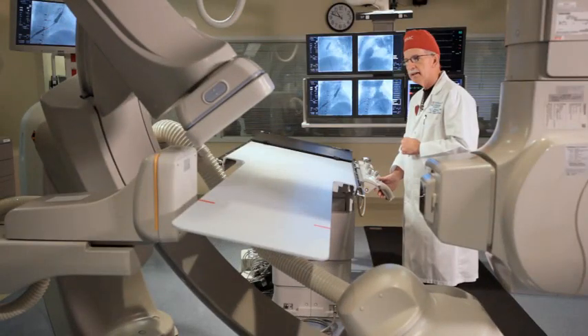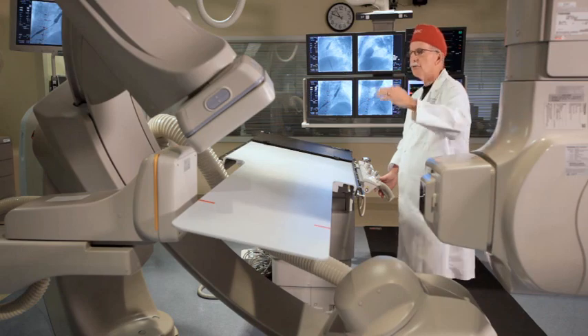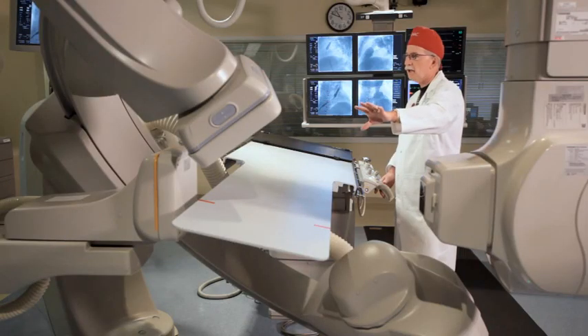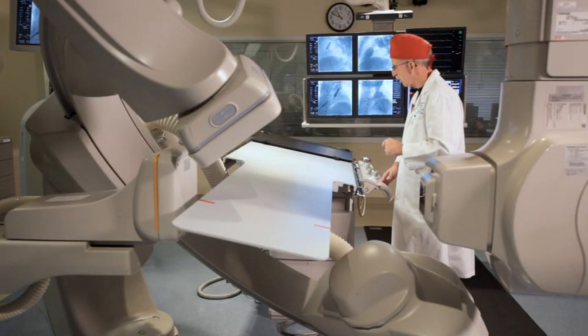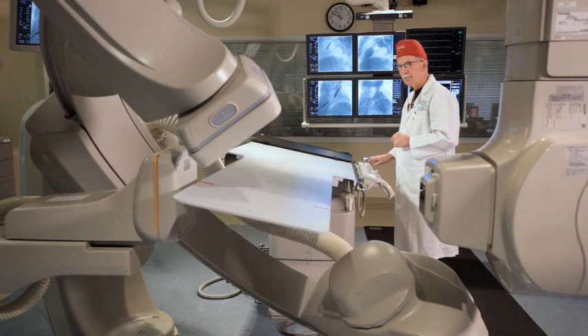A lot of times we'll move the cameras either toward the front — we call it cranial, toward the patient's head. Let's say we got to a point where we couldn't move it any further because we're getting close to the patient or we can't move the angle anymore. Well, with the head-up/head-down feature, we can end up moving the table up like this.